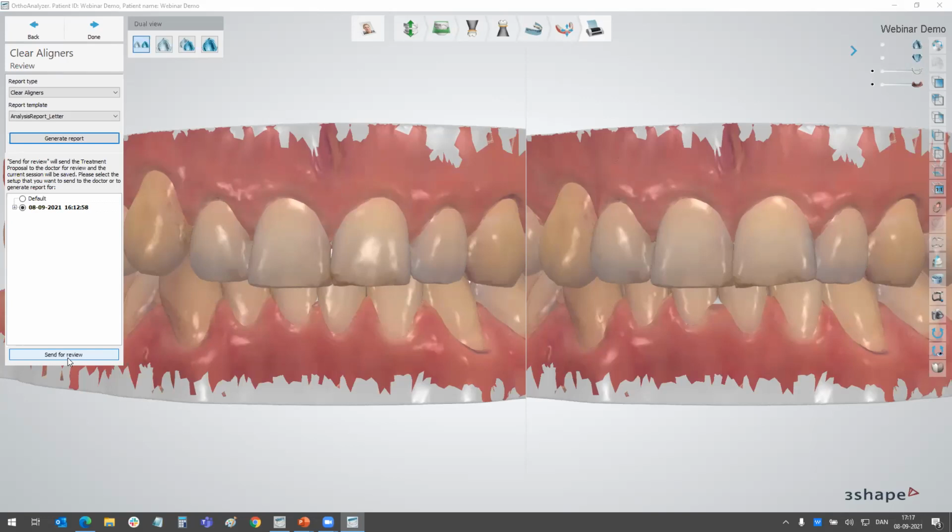Then there's a question about if the hollowing uses a particular printer. When we launch, there will be in the manual which printers we actually support. But if you're outside of the US, you could actually choose any printer on the list, because the shape of the models is not different if you choose one printer over the others. What the printer selection is used for is to warn the user if they set the wall thickness too thin.